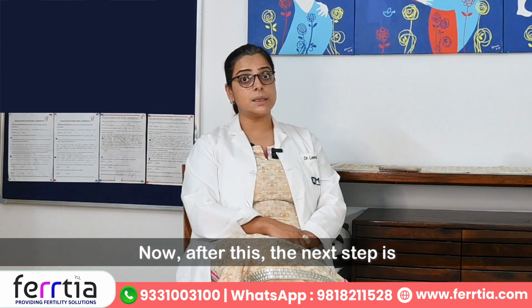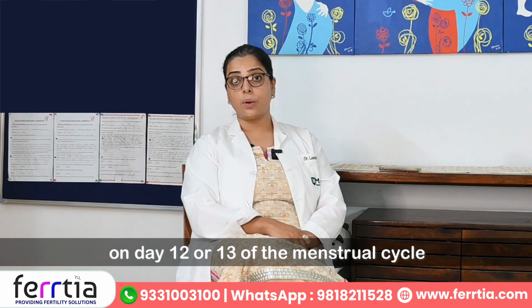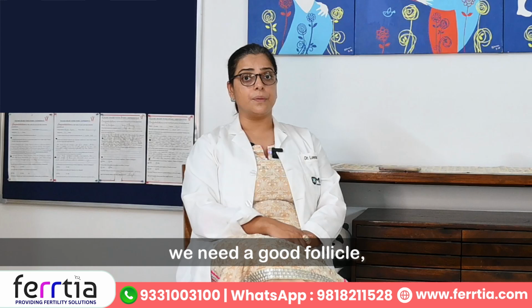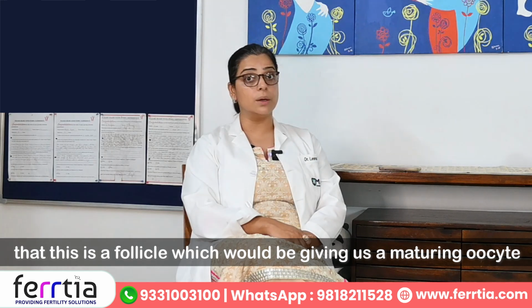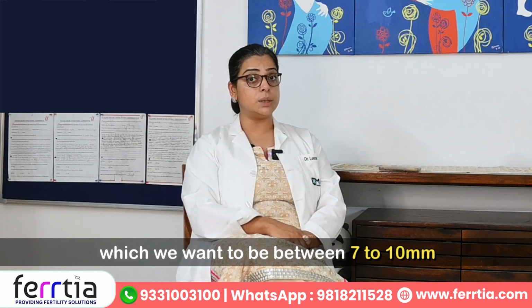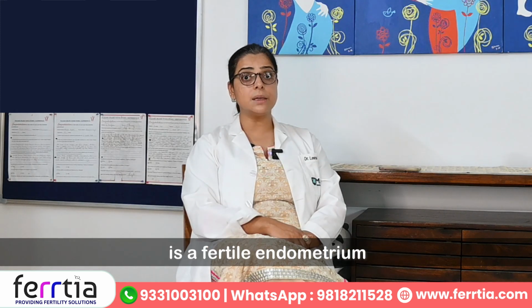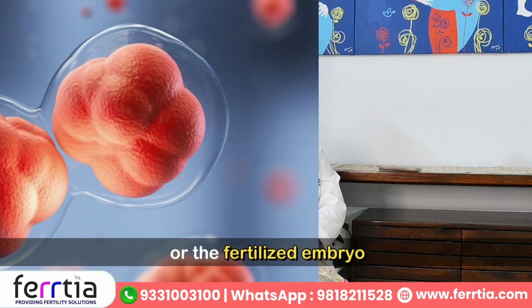Now after this, the next step is that we again repeat the follicular monitoring scan on day 12 or 13 of the menstrual cycle. Here, we need a good follicle which is around 18 or 19 mm, and this suggests that this follicle would be giving us a maturing oocyte which has the capacity to fertilize with the sperm. We also see the endometrium, which we want to be between 7 to 10 mm. Any endometrium which is 7 to 10 mm on a follicular monitoring scan is a fertile endometrium and has good endometrial receptivity for the fertilized embryo.